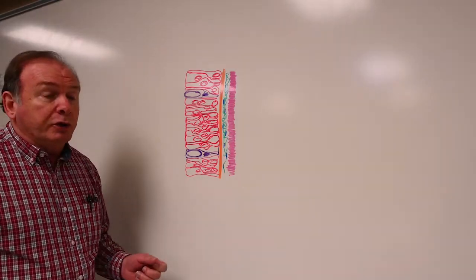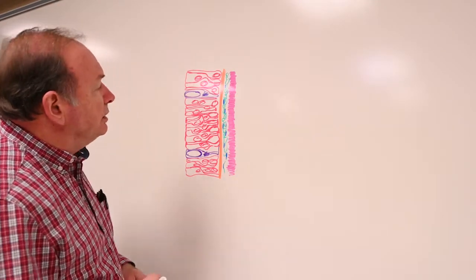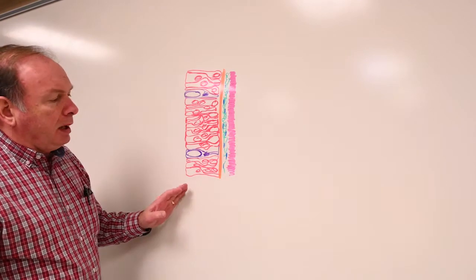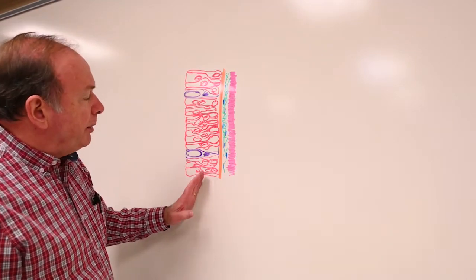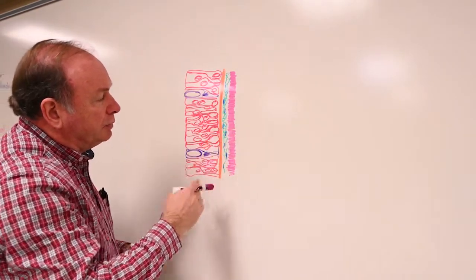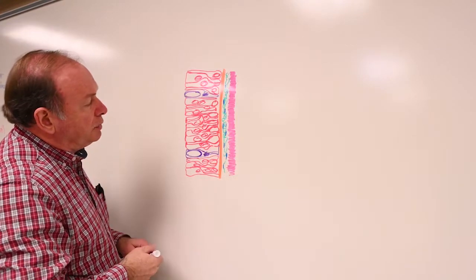Now we'll look at the tracheal wall. We're going to diagram the layers of the tracheal wall first, then we'll go to the microscope pictures and see how it looks in those images there. I've begun by putting the mucosal layer of the trachea here on the wall. The epithelial layer, this orange line, separates the epithelium from those layers of the mucosa below the epithelium. That's your basement membrane in the orange there.